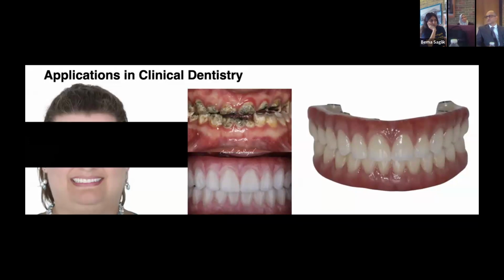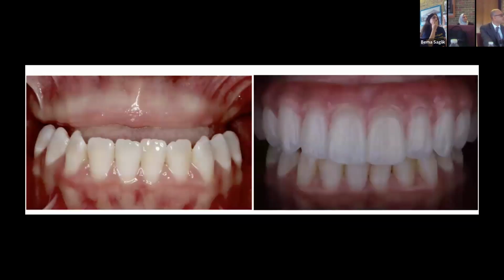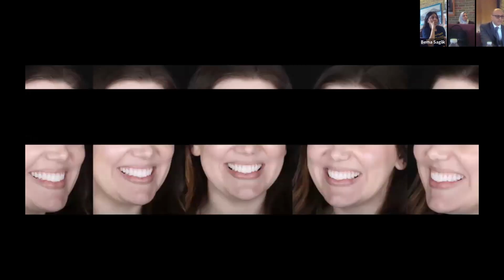Sometimes it happens because of the tissue shapes, and still I get a beautiful soft tissue result, which I have in pictures. And in another case, the patient is completely edentulous, and zirconia restorations completely change the life of the patient. And the failure rate for that, although there are many factors that we have to consider, at least in our center, is less than 2%, which is to me very, very interesting. And we have a long-term follow-up of some of the patients, about 5-6 years now. So these are the patients after providing that.